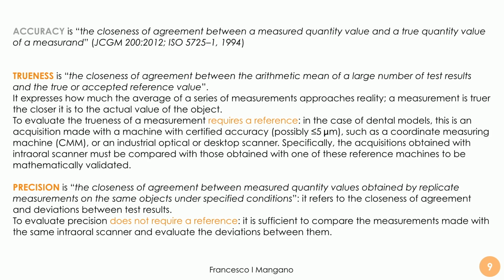But as I anticipated before, to evaluate trueness we need a reference. In the case of dental models, this is usually an acquisition made with a very accurate machine, like an industrial optical scanner with a certified accuracy of less than 5 micrometers, or maybe a coordinate measuring machine. So something that is really reliable in capturing data of an object, and so we can compare our intraoral scans with those data in order to evaluate if our scans are reliable or not, if they are true or not.